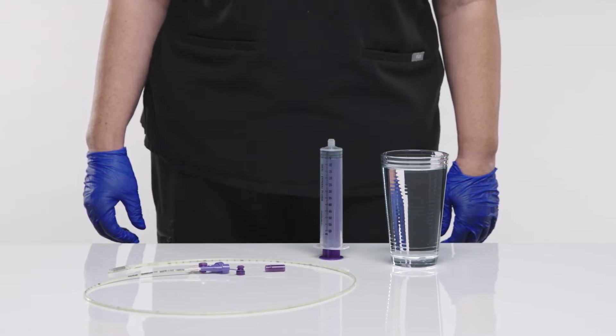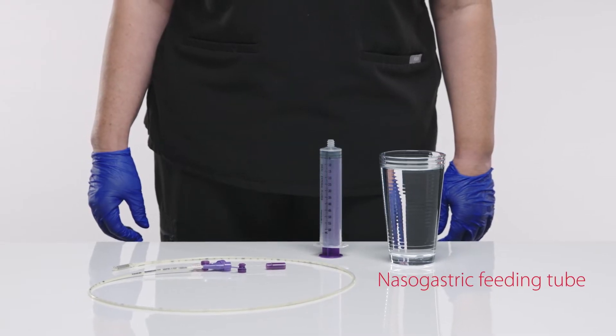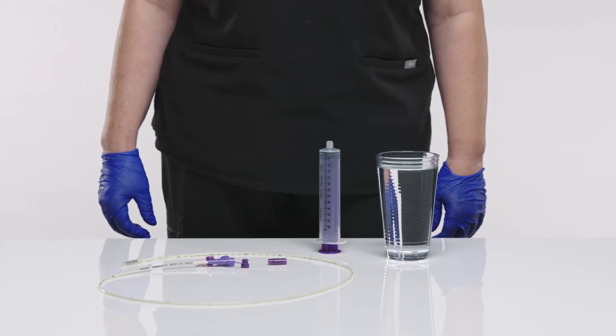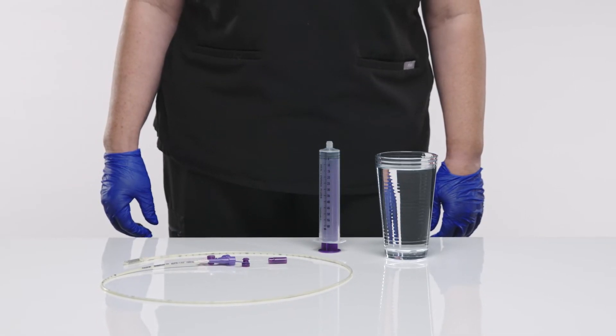Next, gather the following supplies: nasogastric feeding tube, water, or lubricant. Measure the patient from the tip of the nose to the earlobe and down to the xiphoid process.